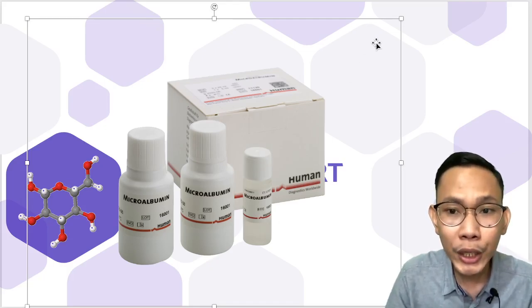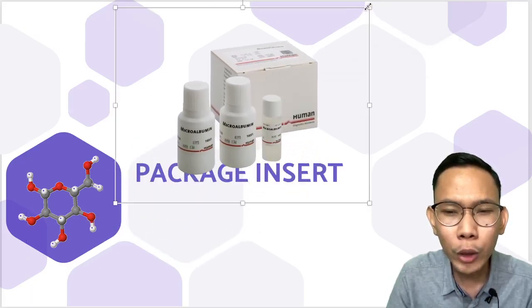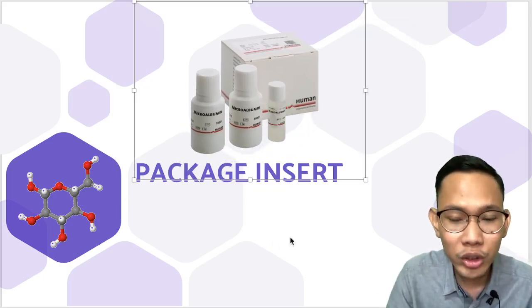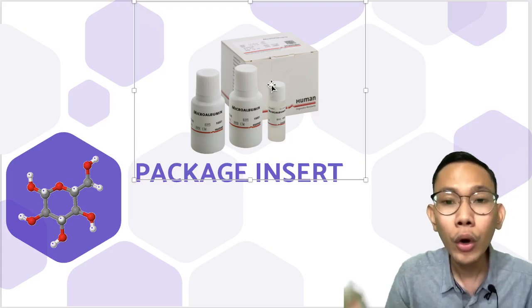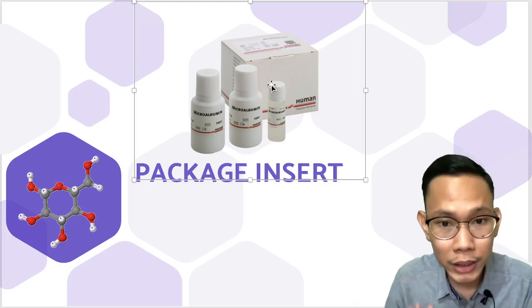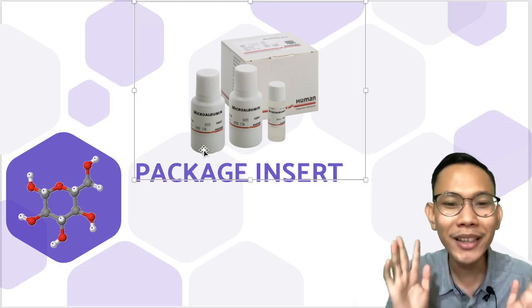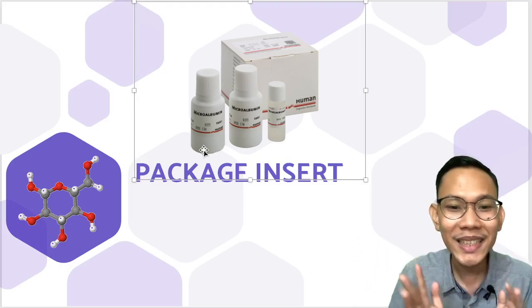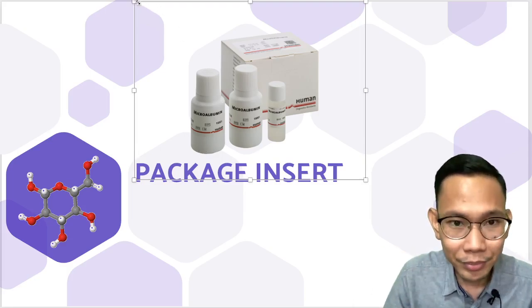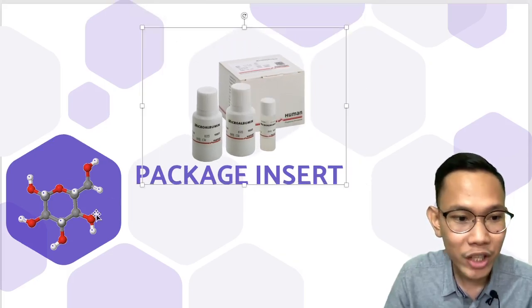The package insert I'm talking about is actually similar to your manual, like when you're buying a new phone and a manual comes with it. The package insert is the manual on how to perform the test or the procedure with all of these reagents given. That's the basic concept of a package insert. We include this in the discussion because this is what we actually do.